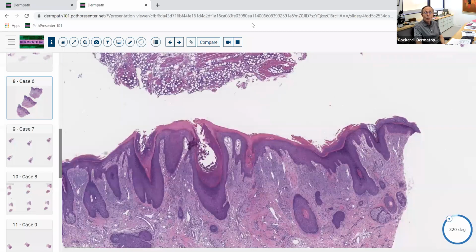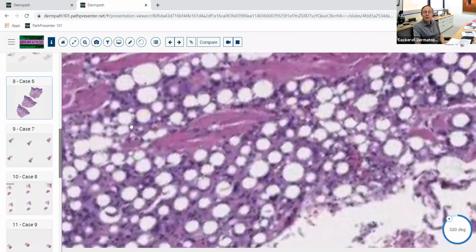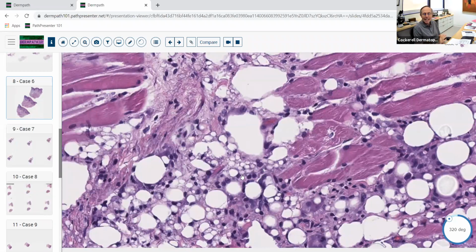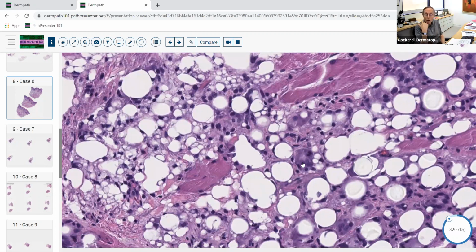Well, look at this area over here. We'll go up to the top one. They've got all of this stuff down in the subcutaneous fat. And notice these little tiny bubbles again here. I just mentioned this to you before. This is silicone, a beautiful classic example of a silicone reaction. Normally silicone will give you a little bit of fibroplasia, maybe a little bit of inflammation. Here you've actually got some granulomatous inflammation. So this probably was a silicone foreign body reaction. They probably had a lump in their skin and started saying, hey, I don't like this here. I'm going to start rubbing and feeling it and trying to get rid of it.